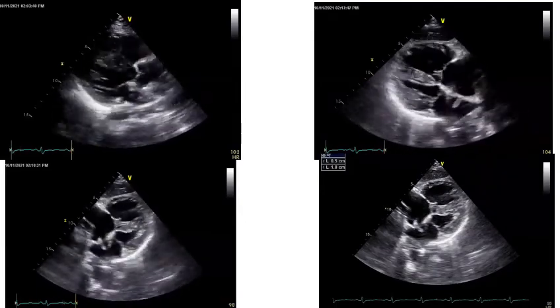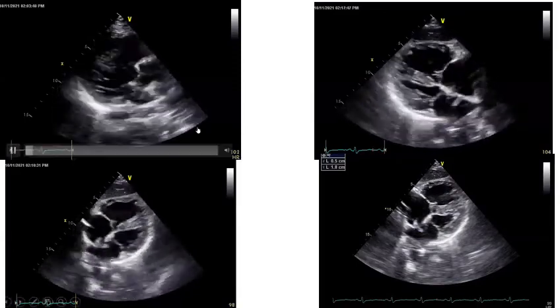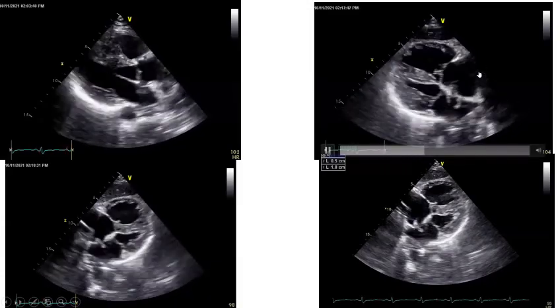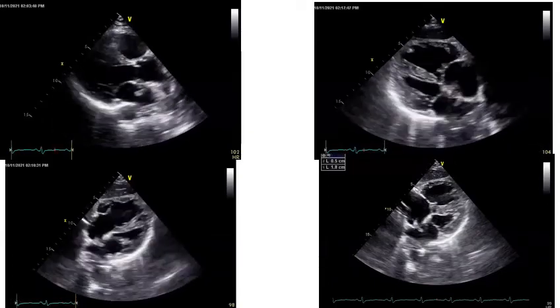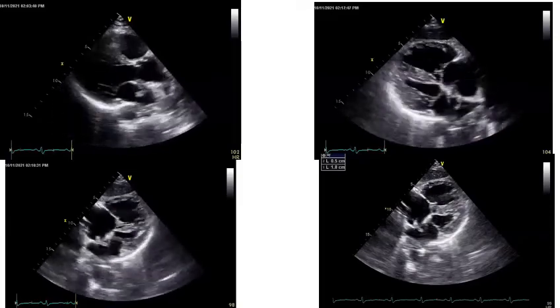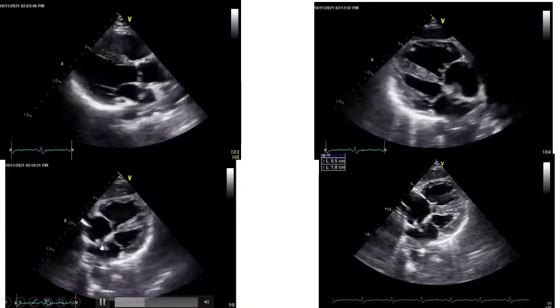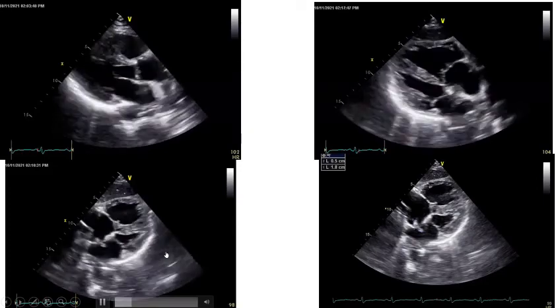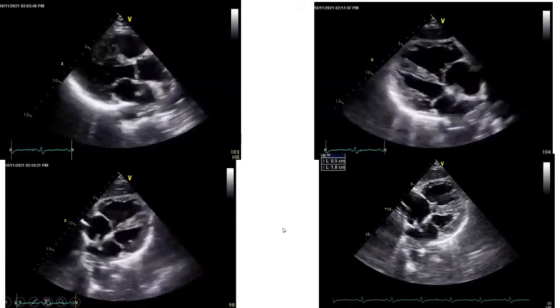The patient presented with a stroke and also had evidence of, you can see that her right ventricle is significantly enlarged. Right atrium is enlarged. She has got evidence of pulmonary artery hypertension, so she must be having chronic thromboembolism into the pulmonary system, giving rise to pulmonary artery hypertension and RA and RV dilatation, and then she has got evidence of thrombus in transit. Thrombus in transit going through the foramen ovale. And what is the treatment?